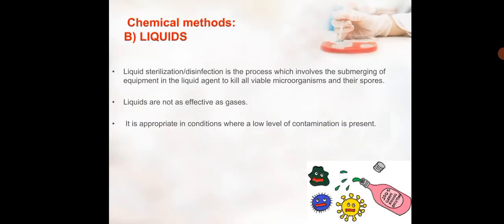Coming to the liquids, liquid sterilization or disinfection is the process which involves the submerging of equipment in the liquid agent to kill all viable microorganisms and their spores. Liquids are not as effective as gases. These are appropriate in conditions where a low level of contamination is present.